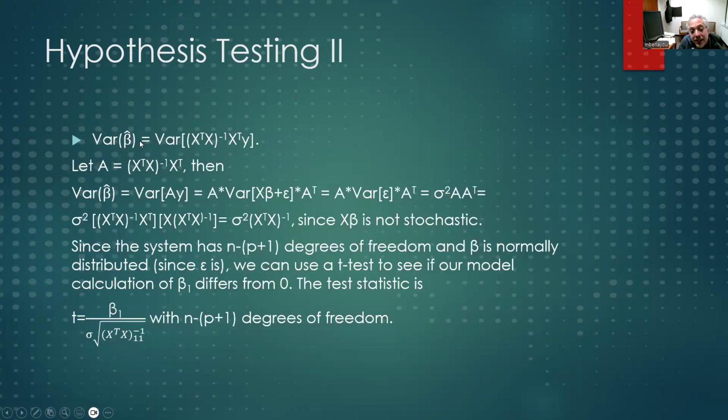And you can calculate the variance of beta, which is important because once you know the variance of beta, you can calculate a t-test essentially. A t-test is where you say, I've got a mean value that's a little bit from 0, let's say, but until I know the variance for that normal distribution, I don't know the statistical likelihood that this is slightly away from 0.